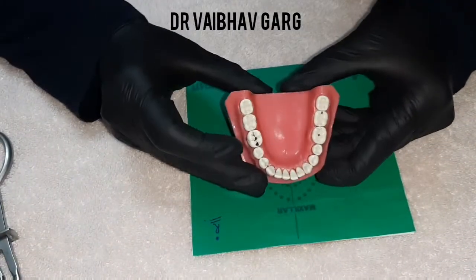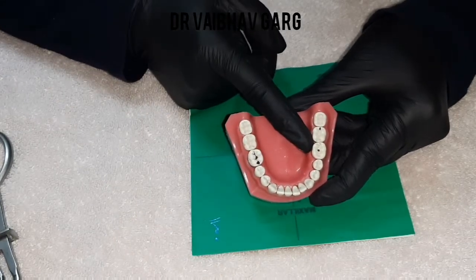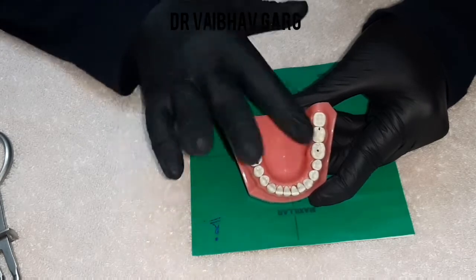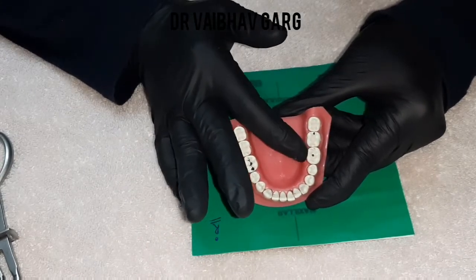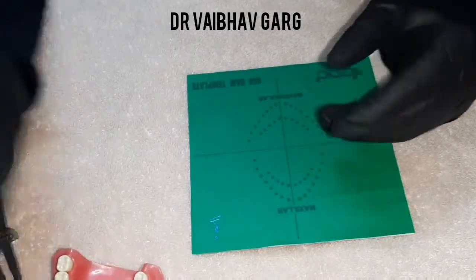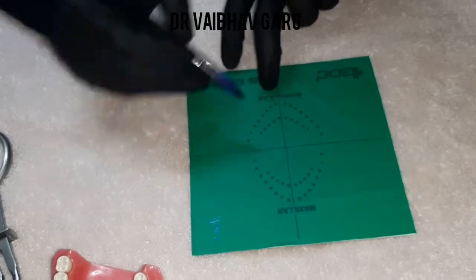Let's take an example of lower mandibular teeth. We will do tooth 3-6, the first molar of the third quadrant. Starting from the midline, we count: 1, 2, 3, 4, 5, and 6 — so this will be the third quadrant mark.